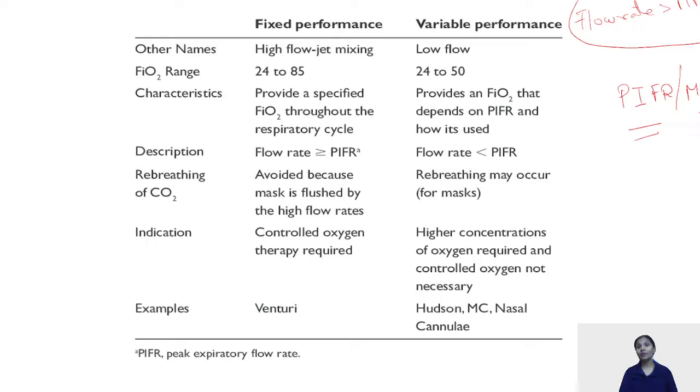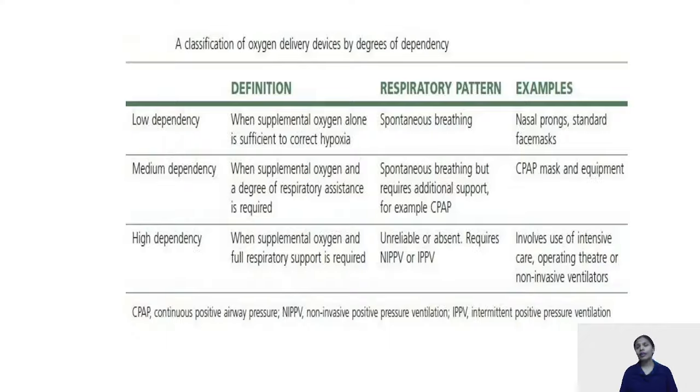I hope I have made myself very clear about the fixed performance high flow devices and variable performance low flow devices. We have already discussed the dependency: low dependency, medium dependency, high dependency. In low dependency, we have spontaneous breathing that is present. We have your nasal prongs or your face mask.